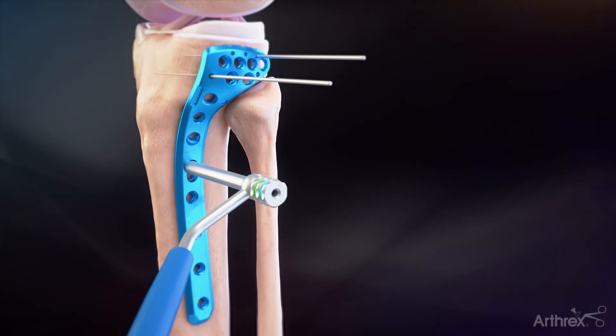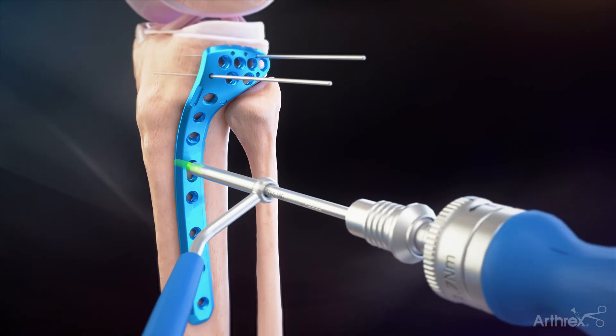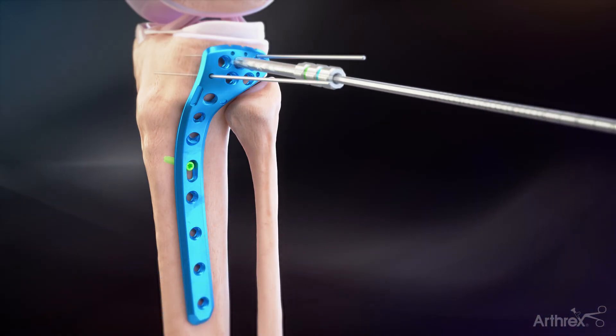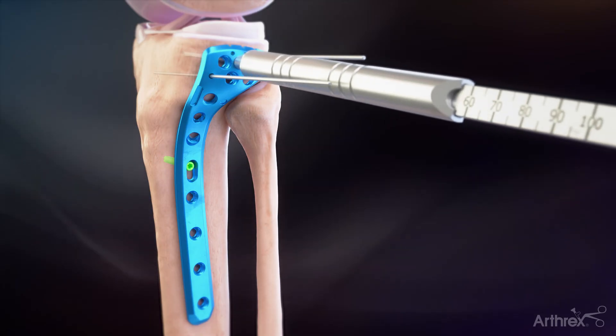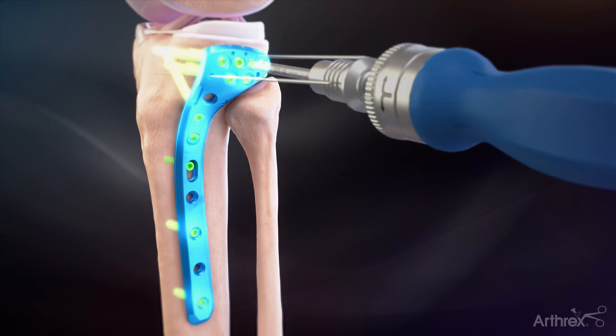For drilling at the nominal angle, the 2.8 mm fixed angle snap-in drill guide can be used for the 4.0 mm fixed angle locking screws, 3.5 mm cortical screws, or 3.5 mm variable angle locking screws.